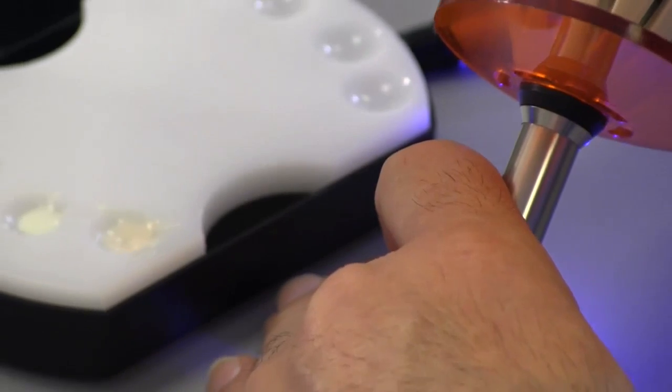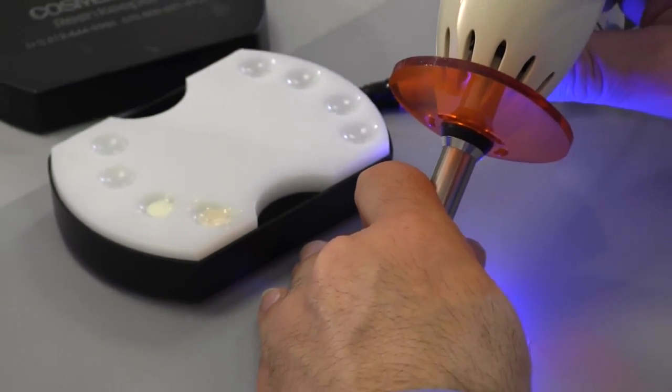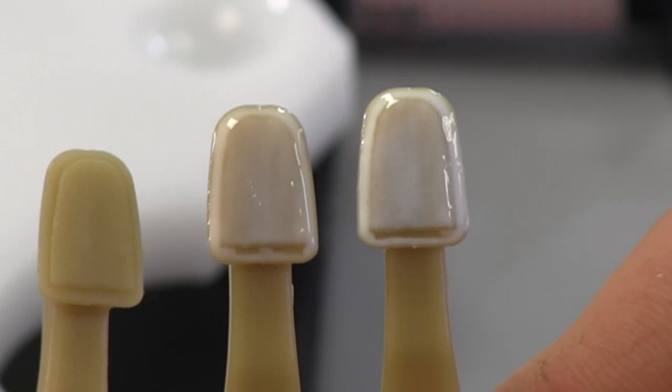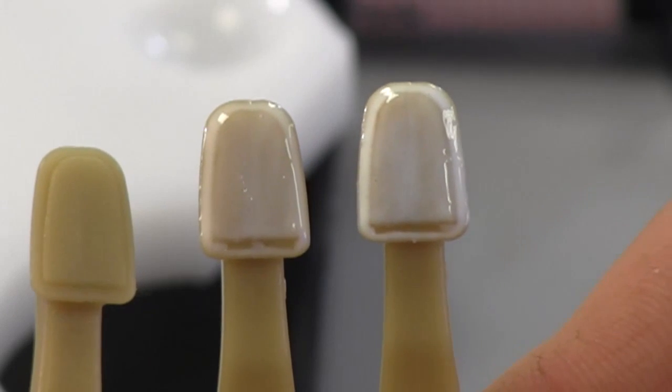We'll cure this for 10 seconds. And then we'll show you the difference between the White Opaque and the Pink Opaque. If you notice on the far left, we started with our C4 shade tab. Then in the middle we placed our Pink Opaque.